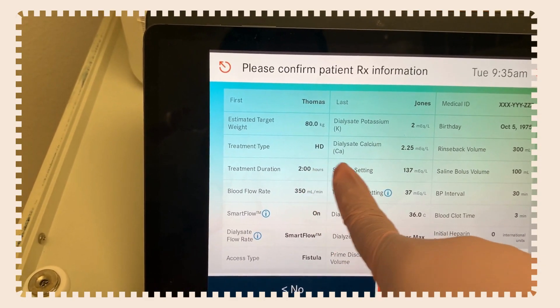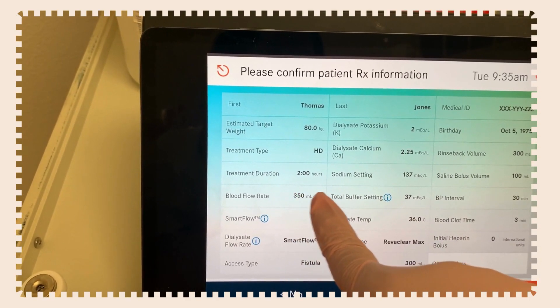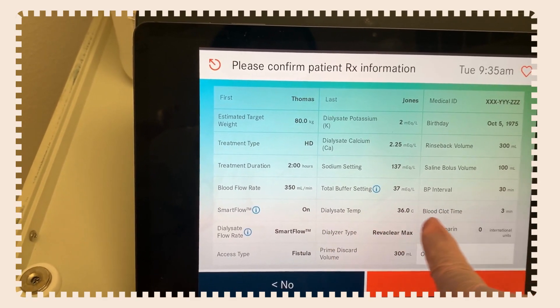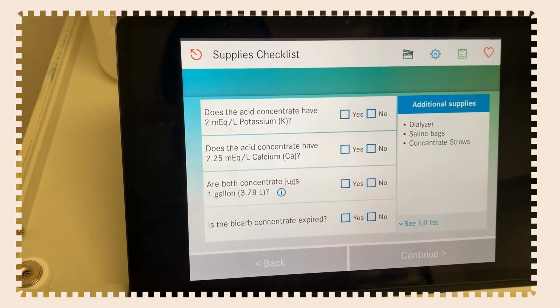You'll also see your rinse back volume, your treatment duration, your sodium setting, your saline bolus, blood flow rate, and everything else we'll get into at another time. Once you've confirmed everything is correct, hit yes to continue.